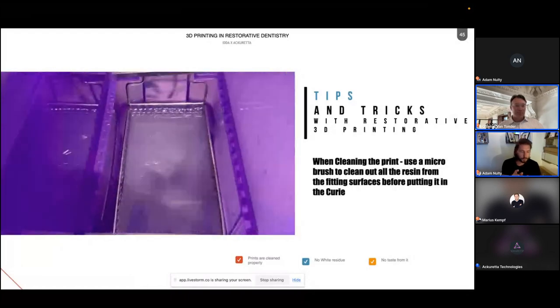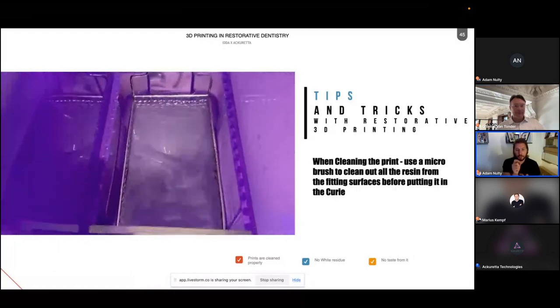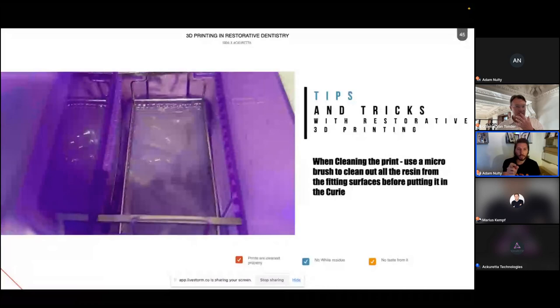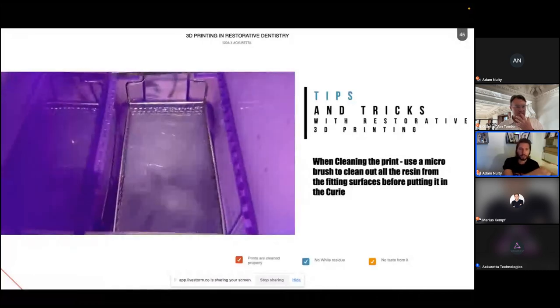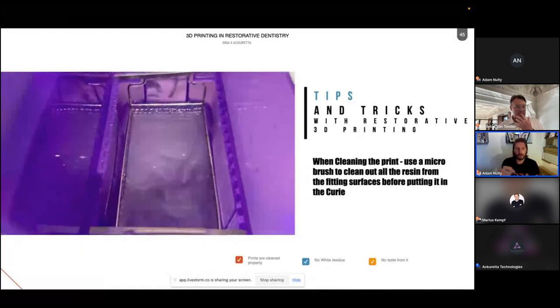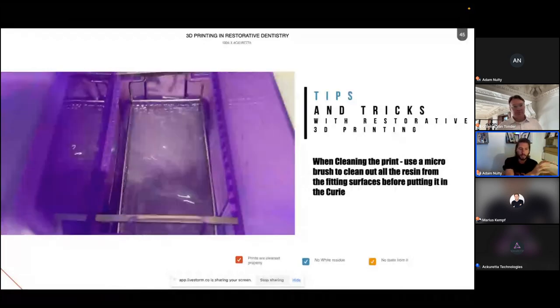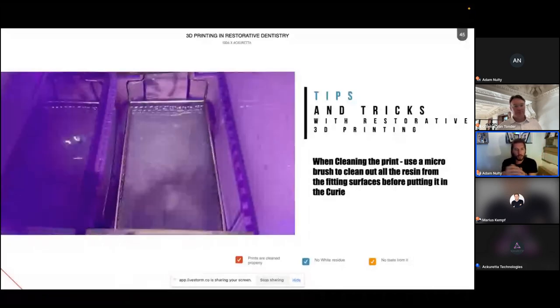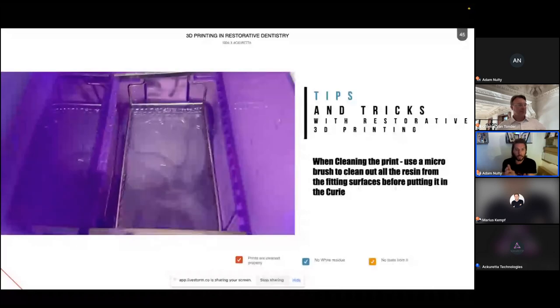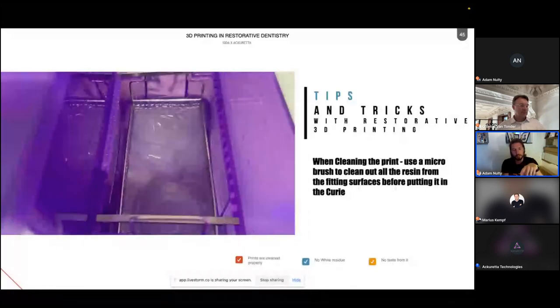Before you go on, just something to add that's a really nice feature of the cleanie as well. If you're using different platforms, then on my IPA side, you can see in this video the metal bars that run across. I have that wider on the IPA side for the full platform because I'm going to be printing models. I have that close together on the biocompatible wash side so that I can have my small platform just sit into place.